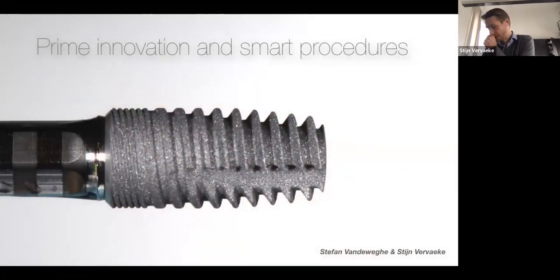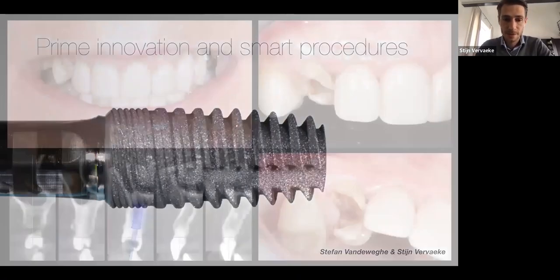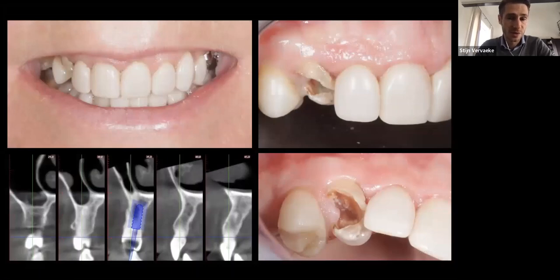So I promised, I'm sorry, I promised to show you this implant, which is the latest development of AstraTech. This is the Prime Taper implant that was launched at the EAO meeting in September. And this is an implant which, again, has all the features of the EV implant. So we still have the micro threads, we still have the same EV connection. So it's the conical connection with the platform shift, and we still have the OsseoSpeed implant. Now, what they did here is they changed the thread design. So now we have cutting threads, cutting flutes, and we have a tapered implant. And of course, this is an ideal implant to secure primary stability in more demanding cases, such as immediate loading cases, and a case like this, immediate placement and immediate loading cases.